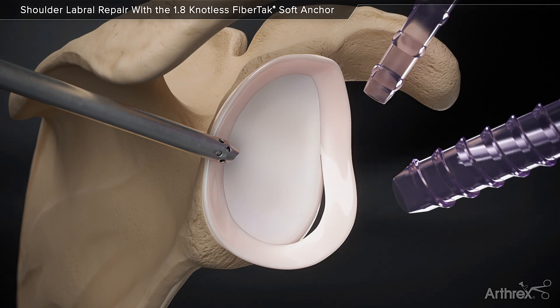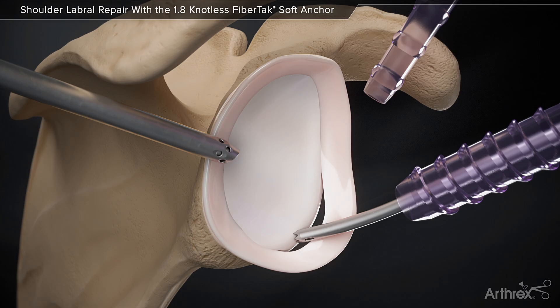A curved guide is introduced through a cannula. After locating the position on the bone surface, a flexible 1.8mm drill is introduced to create the bone socket.